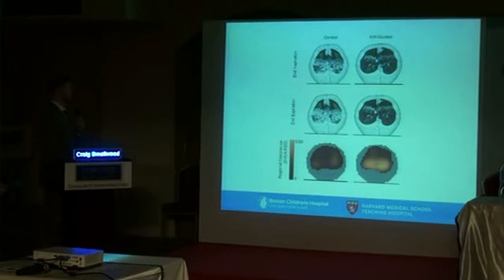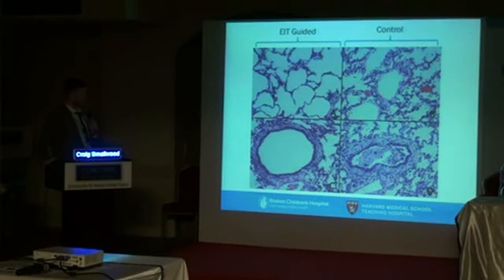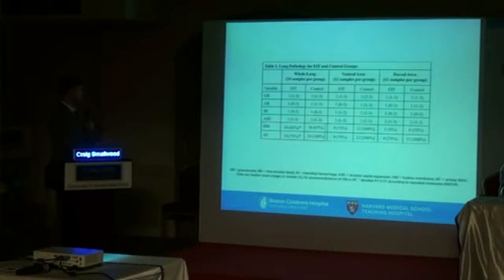And this is a comparison of the control and the EIT guided, but this time we're comparing what the regional compliance looked like between those images, and clearly in the EIT guided group we have an increase in ventilation in the dorsal regions. We also performed some histopathology with our colleagues in the hospital, and on the left-hand column is the EIT guided group and the control is over here. And what you can see is in panel A, there's an absence of hyaline membranes following EIT guided, and there are hyaline membranes denoted in these regions, right there and right here in the control group. And then in panel C, you can see that there is an absence of airway fibrin. So this is like a nice clear airway here, and that is not the case in the control group. And those findings were statistically significant. We looked at the whole lung, and for hyaline membranes and airway fibrin material, we found there were statistically significant differences.